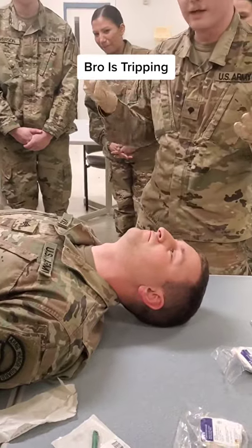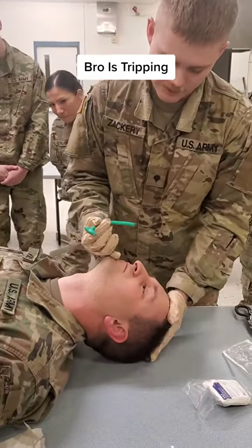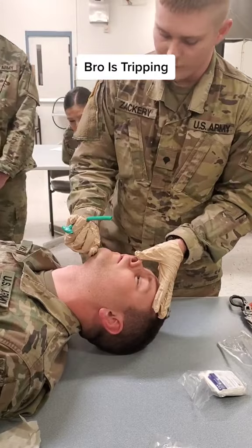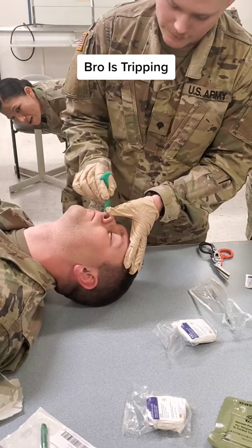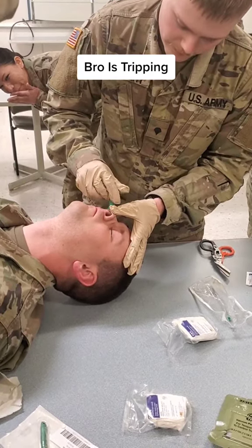All right, their right side if you can, preferably. If not, same process for the left. You're gonna take head tilt chin lift — that's gonna open up the airway. Pig nose — make him look like a pig. All right, do I shove it in like this? Straight down. All right, swallow.